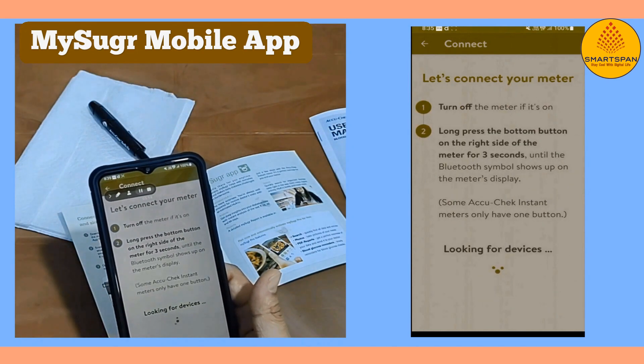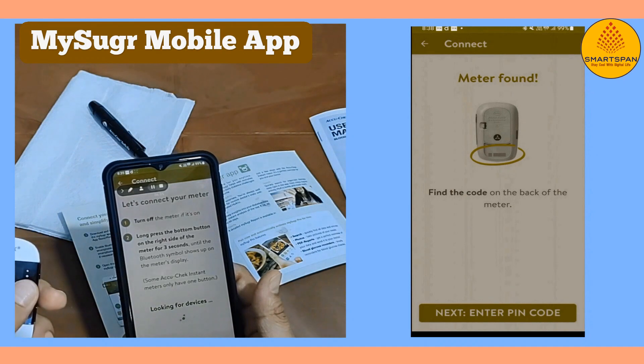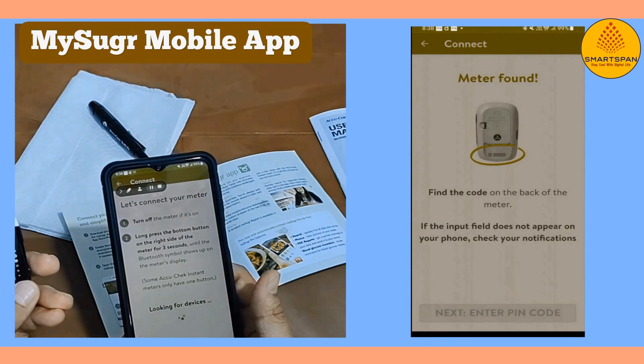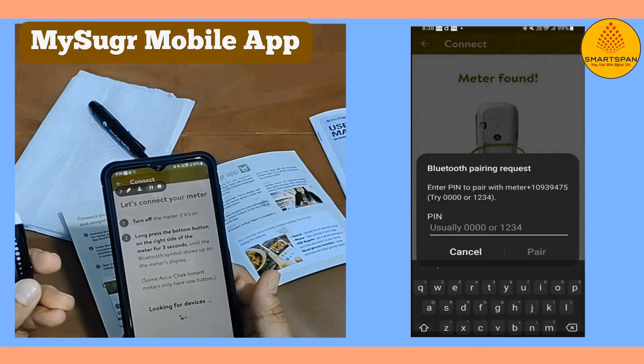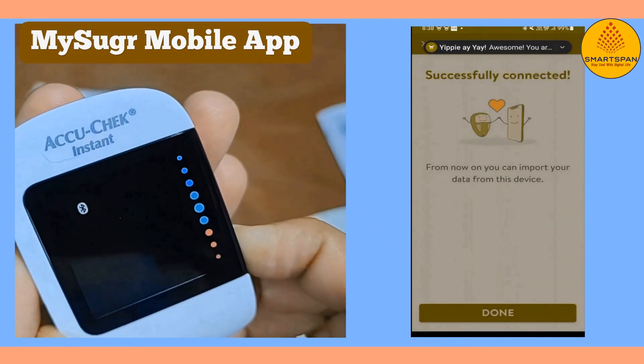Features include integrating data with Bluetooth-enabled AccuCheck Guide Meters, availability for both iOS and Android, an easy-to-read display, and it allows easy creation of PDF reports to send to your healthcare professionals.